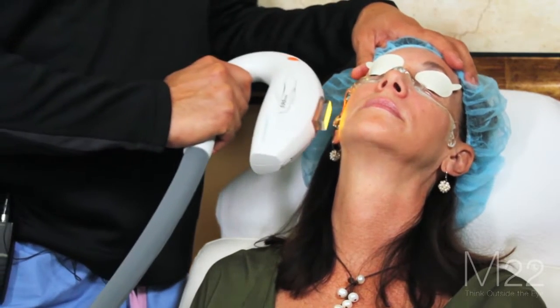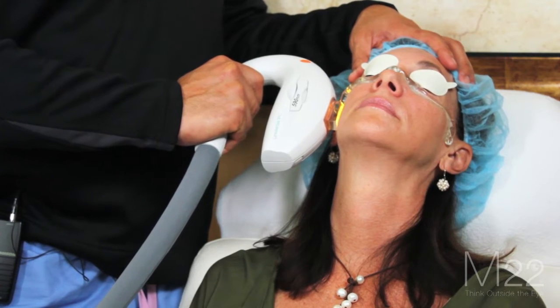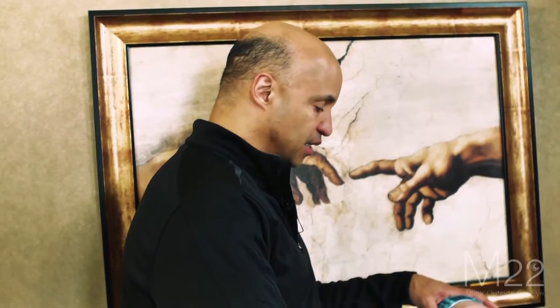What you want to do in treatment is you don't want to push down on the skin. If you do, you'll close off any little abnormal telangiectasia. So you just want barely contact on the skin.